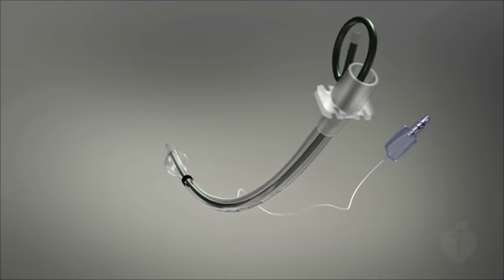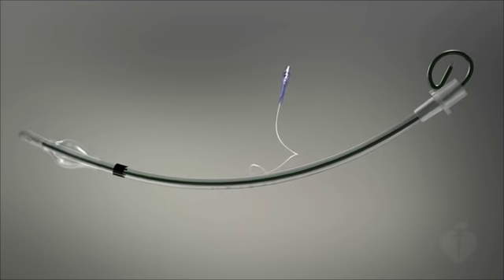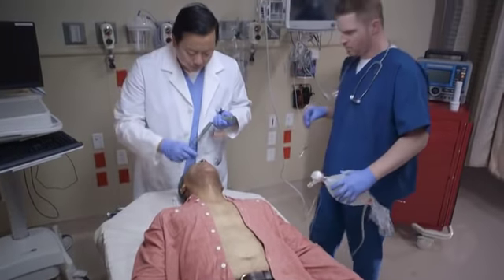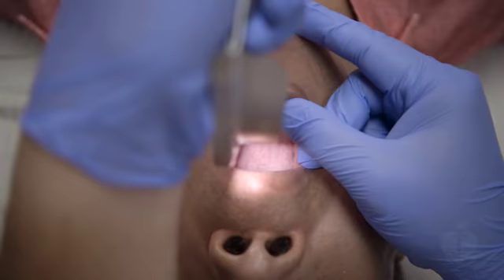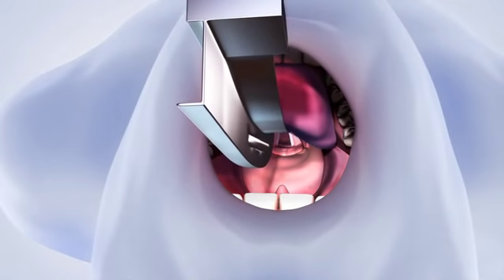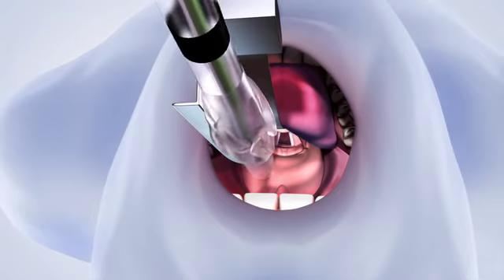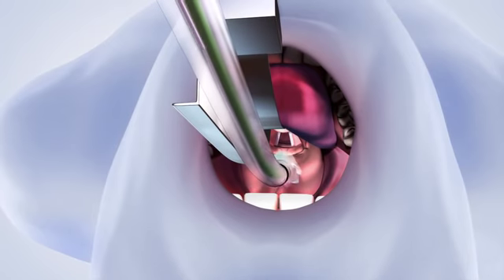The endotracheal tube is a single clear lumen with a single cuff. To insert the endotracheal tube, place the patient's head in the sniffing or neutral position. Insert the laryngoscope blade into the patient's mouth. Lift the laryngoscope vertically up and away to expose the vocal cords and glottic opening. Insert the endotracheal tube directly between the vocal cords and into the trachea until the cuff passes the cords.